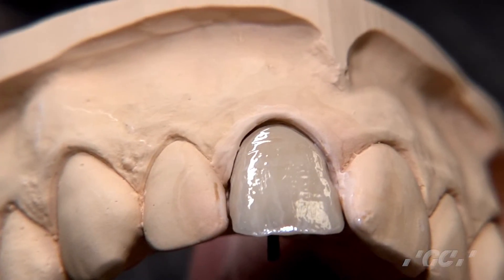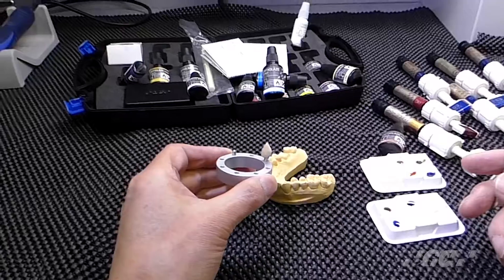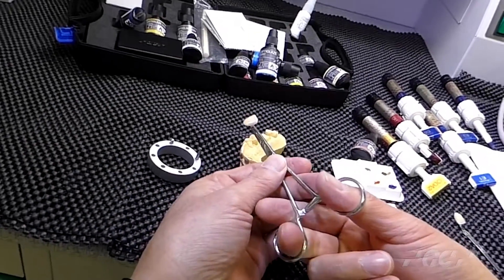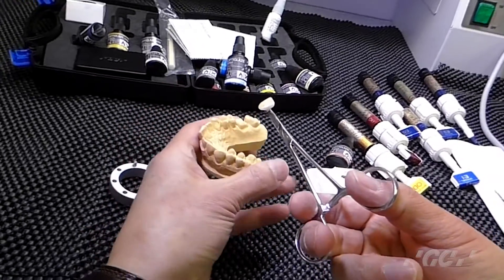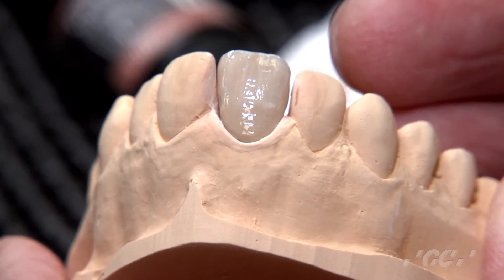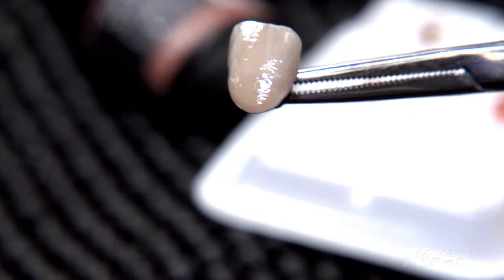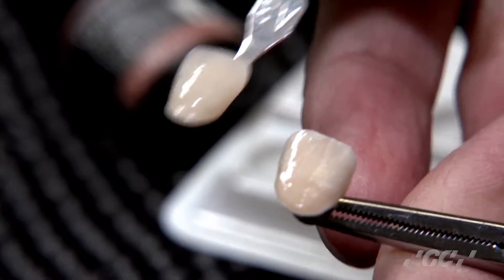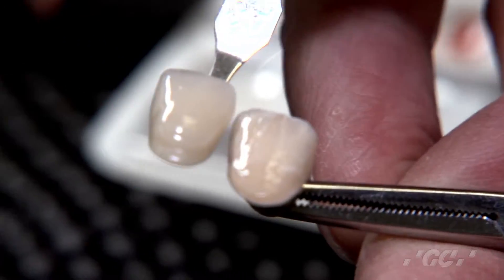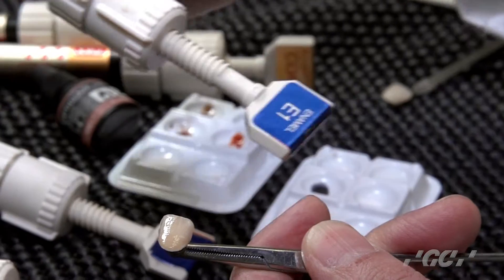Then after that, before you apply the enamel layer on top, I'd like you to cure for five minutes with light cure. This is after light cure for internal stains. Then return to the model. We decided which enamel layer to put on top of this crown. The target shade is A3, but my crown turned out a little darker than target shade A3.